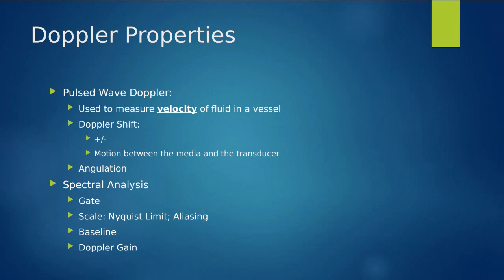This reflector, which could be the aorta, it could be the IVC, whatever vessel we're Dopplering, it reaches that. And because that structure is moving, it's a vessel. Remember, it's either going to pulsate or it's going to go with our breathing, so it's respiratory. But either way, our arteries and our veins are constantly moving. And that Doppler is picking up that shift in the movement from the vessel. Okay, so it's picking up the motion between the medium, so between the vessel and the transducer. And that's how we can see these reflections on our screen.